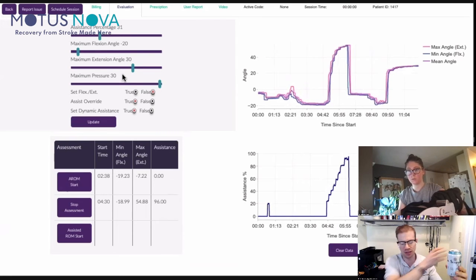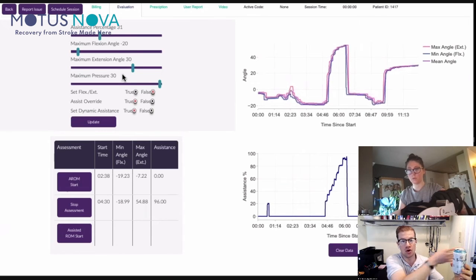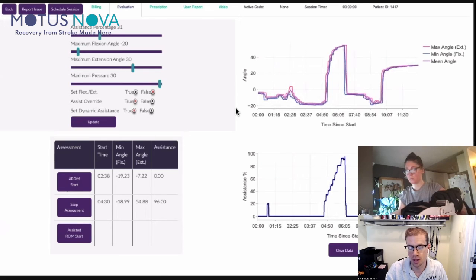If I'm just closing my eyes, I have no information about whether I'm reaching for the correct place or where I am in space. But if I have visual information about where my hand is with respect to the can, I can go, oh, I overshot it to the right, or hey, I overshot it to the left, or hey, I'm right on it, but I may be a little bit low, right? That visual feedback will help you reorient, rescale those intentions that you have. Mm-hmm. That makes sense. So I'd very much encourage you to use your vision to help with that learning process.